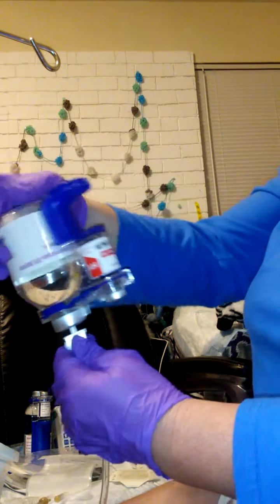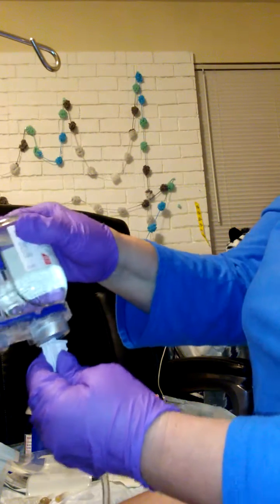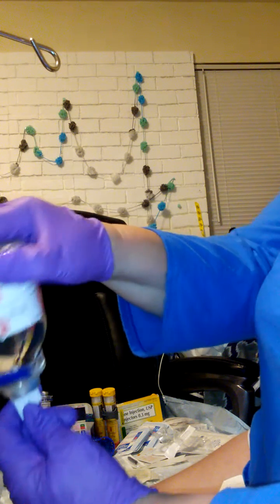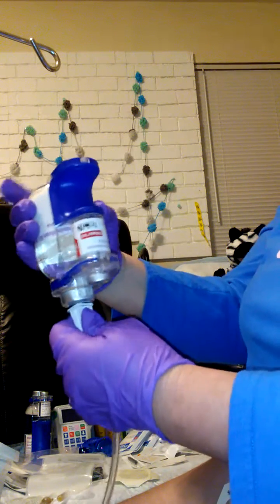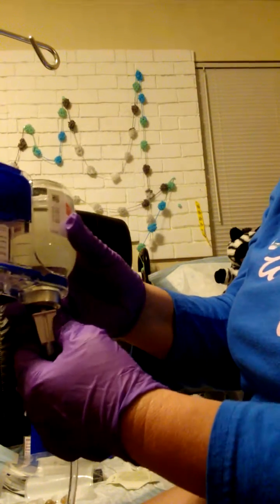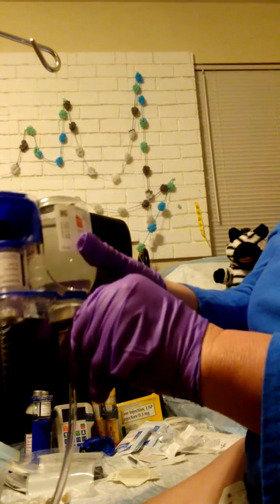You have your needle or blunt thing all the way up in there. This is going to go out. It usually goes out really quickly. This comes off.